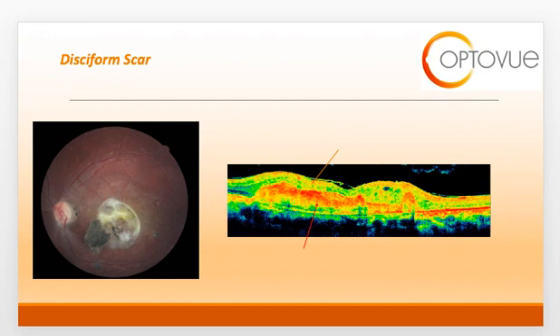On OCT, a disciform scar appears as a hyperreflective area with distinct borders underneath the neurosensory retina. You can see a complete loss of the outer retinal layers and photoreceptors above the scar. Cystic spaces, visible as hypo-reflective areas, occur in the inner retina due to the degenerative changes occurring throughout the retina.